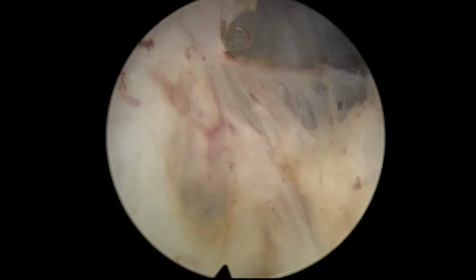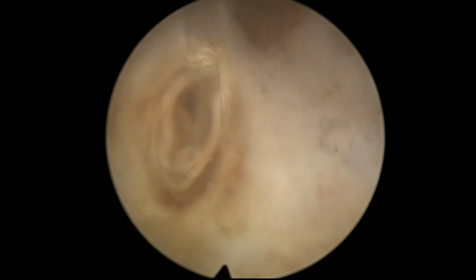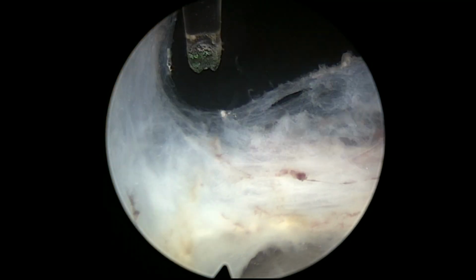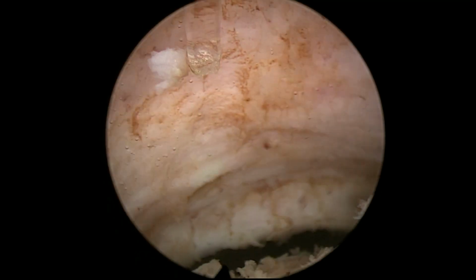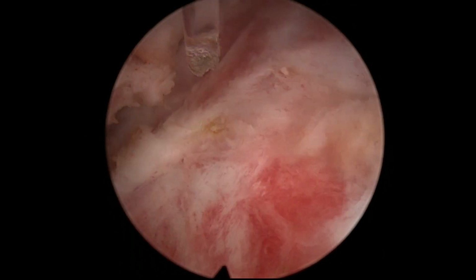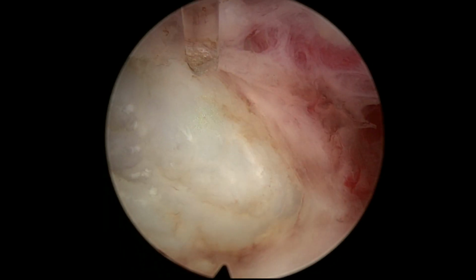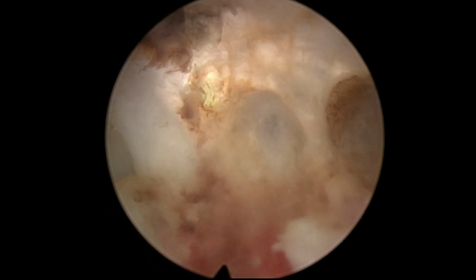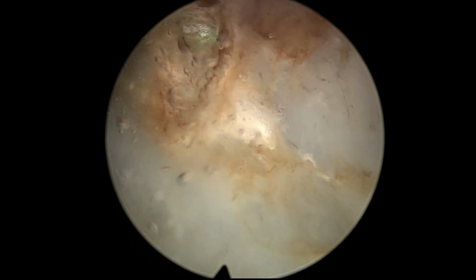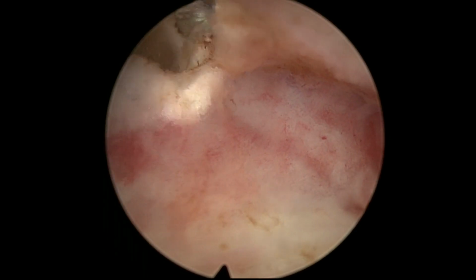all around, just following the same steps of the en bloc technique with early apical release that I usually do and recommend. I really think it's an approach that is universal. You can do this procedure using the same technique with different sources of energy. And as you can see, it is very fast. It allows you to see very well. The irrigation is excellent. So it's very exciting to be able to try a new tool.